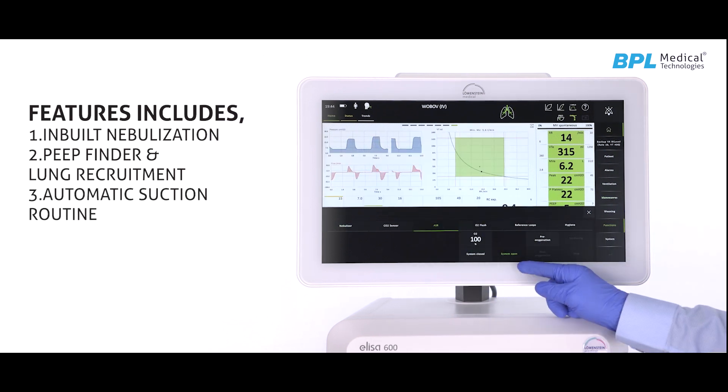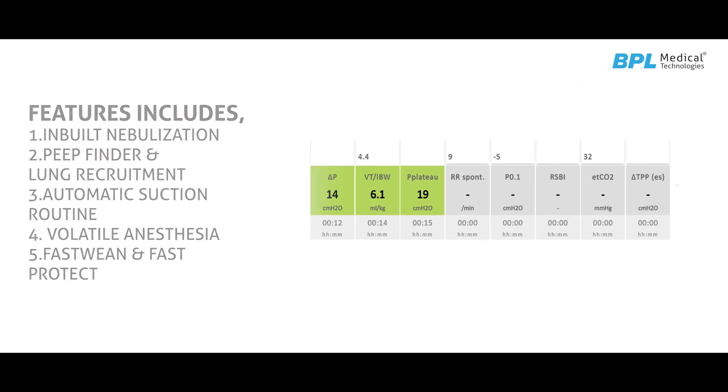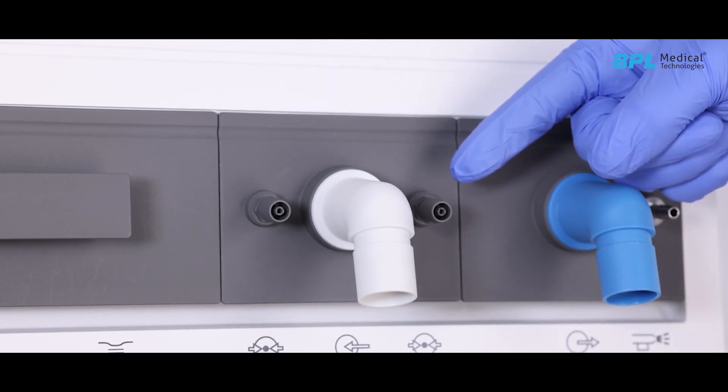Additional features include automatic suction routine, volatile anesthesia, fast wean and fast protect, optional upgradable features, transpulmonary pressure measurement and cuff scout, and ET cuff pressure management.